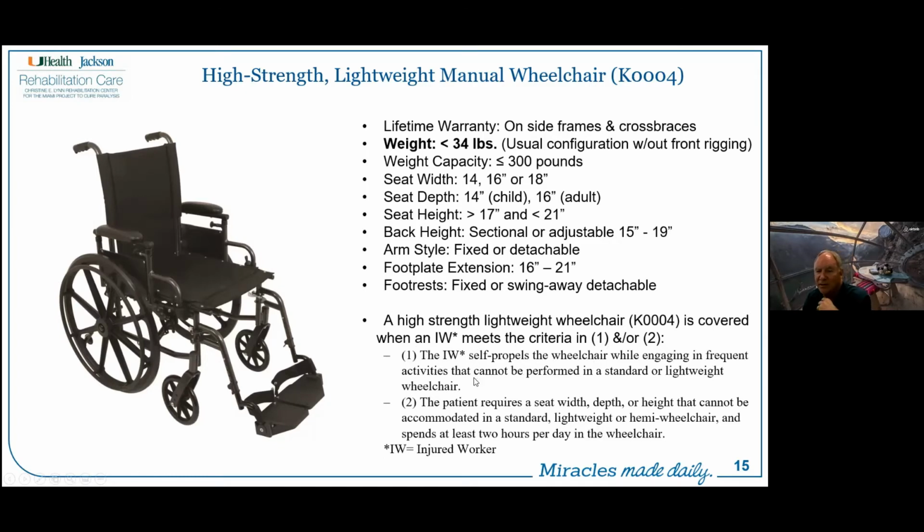In 1, the person is able to self-propel the wheelchair while engaging in frequent activities that cannot be performed in a standard or a lightweight wheelchair because of the person's body weight. And 2, the patient requires a seat width, depth, or height that cannot be accommodated in a standard, lightweight, or hemi wheelchair, and they have to spend at least 2 hours per day in the wheelchair.